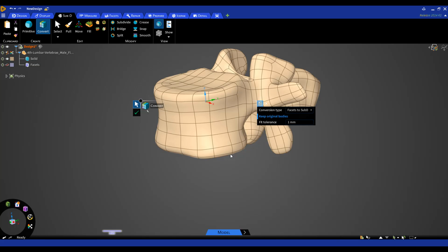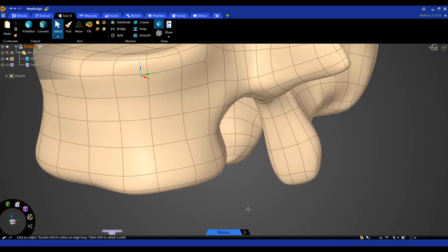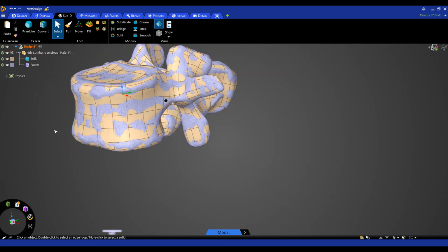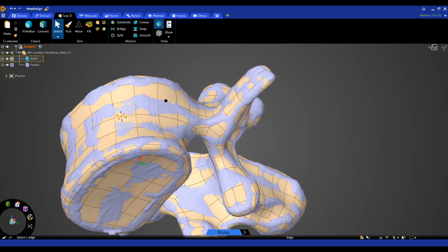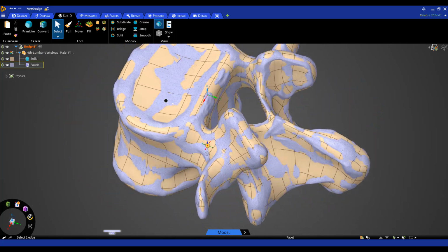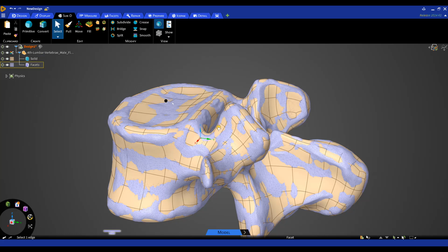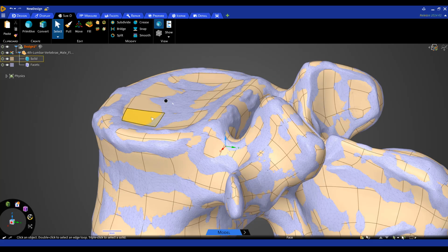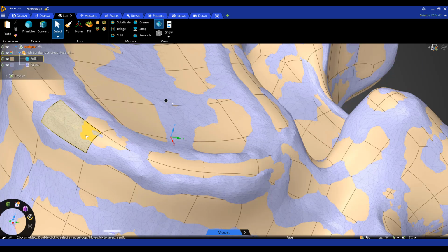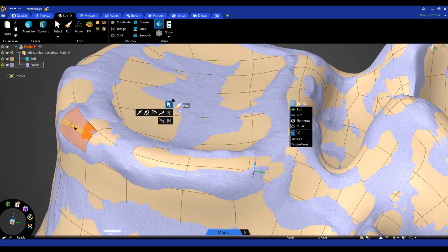Okay, that's it. So we have a SubD model here. We also have the STL here. So I can choose to see the STL. You can see the way that the SubD model takes on the shape of the STL without capturing all of the details. With subdivision, we can choose to move things around. So for example, if I feel like this surface should protrude a little bit more, I can grab it and I can just pull on it.